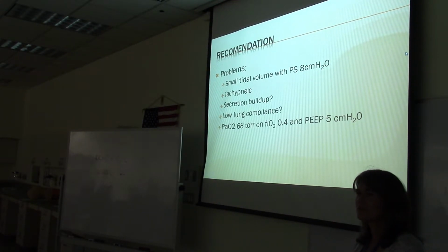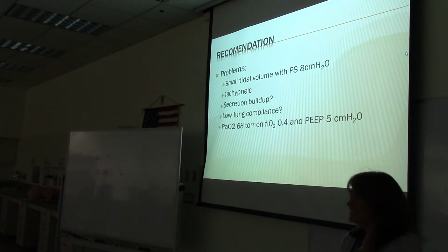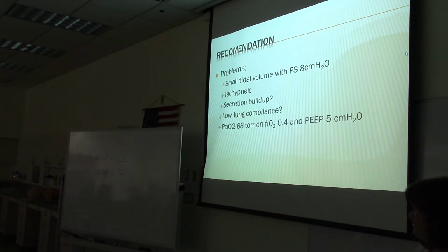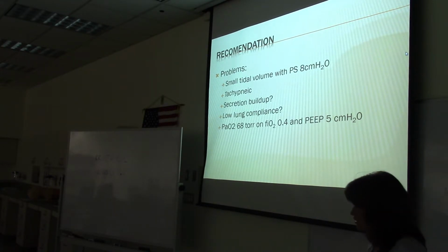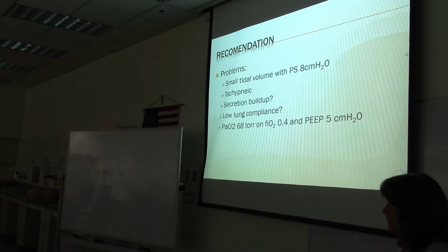Pull the plug? No, what? She said full support. Oh, full support. We're gonna move on that easily. You probably should suction though for the high PIP. Okay, very good. Yeah, it's possible that we're seeing all of this because there's mucus plugs plugging up the airway. So suction first. If no improvement, change to full support. Very good. And maybe increase oxygenation of O2.